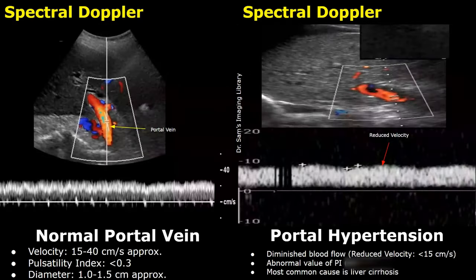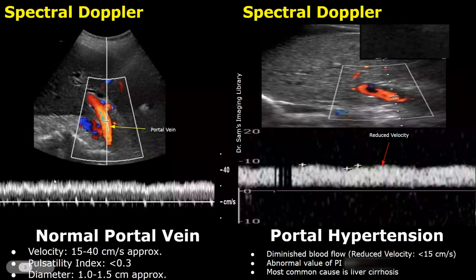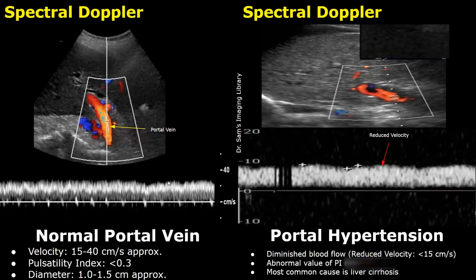Here is a spectral Doppler waveform for the portal vein. This is the normal Doppler waveform — it is a monophasic waveform consisting of forward flow. The blood velocity can vary but it is usually between 15 and 40 centimeters per second.